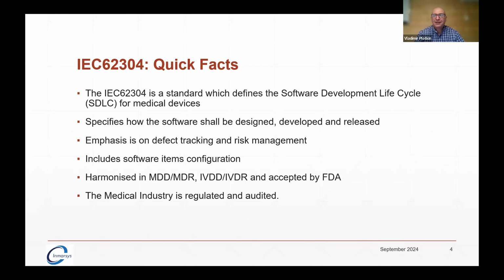The standard is recognized by a lot of notified bodies. I cannot say most, because I never worked with pretty much all notified bodies in every country. But the FDA recognizes it, the European Union recognizes it, and the UK as well. So it's a very good standard to have. Normally when you have an audit, one of the questions they will ask is, are you following this standard or not? And if you're not, you have to explain why. The medical industry, as you know, is regulated and audited. So at some point in your project, you will have an audit, and it's better if you can show that you're actually compliant with the standard and following its guidelines.